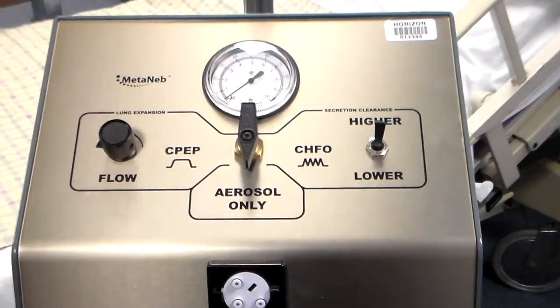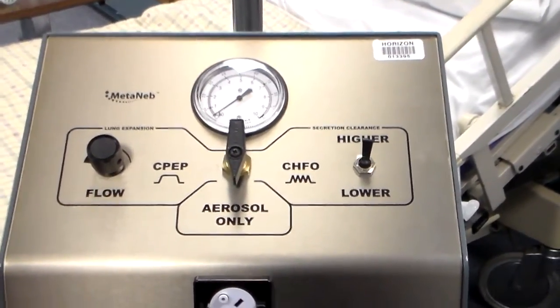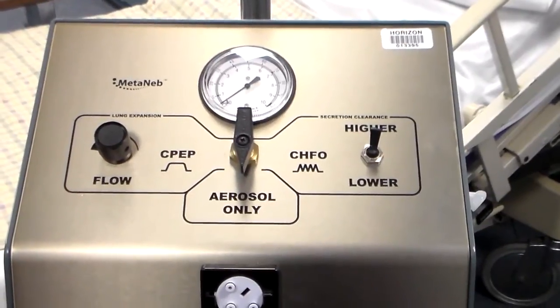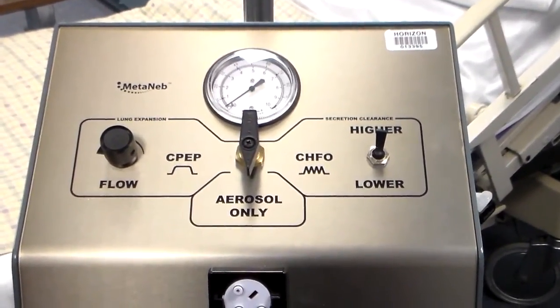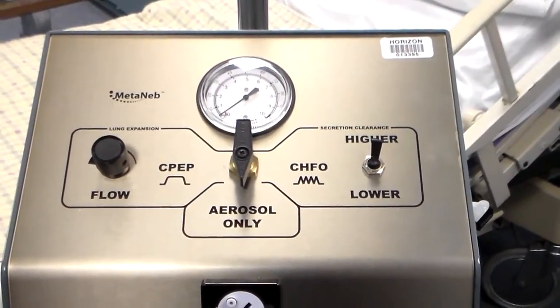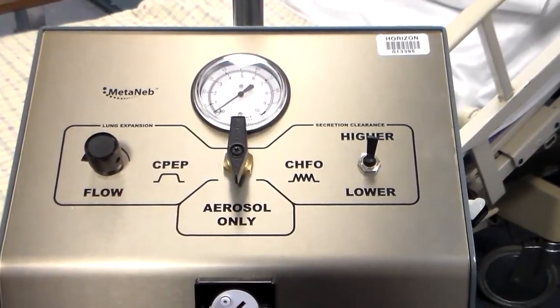Today we will be discussing the Metaneb. Metaneb is a therapeutic device that helps to enhance normal mucus clearance and resolve or prevent patchy atelectasis. The device has the ability to provide 3 different therapies: CPEP, CHFO, and aerosol.